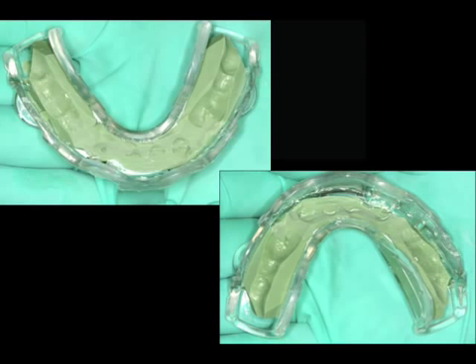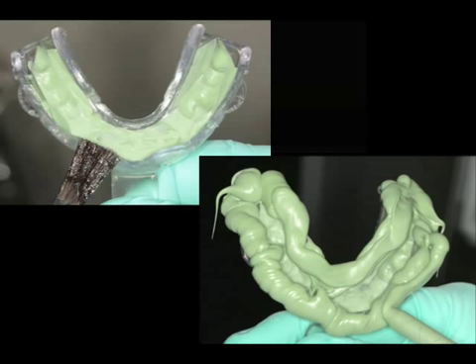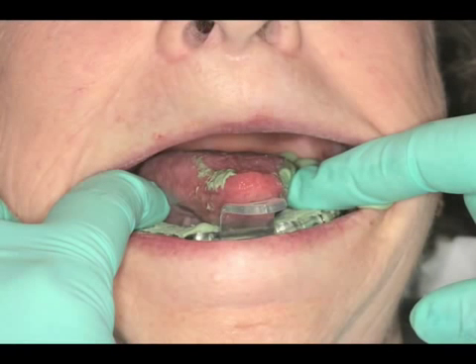Now I'm going to put adhesive around all the border areas. Once I've placed adhesive around the border areas, I'm going to put a rigid viscosity polyvinyl siloxane all around the borders and then reinsert it into the mouth and do a complete border molding procedure. The border molding procedure on the mandibular arch will take into consideration the tongue movements.